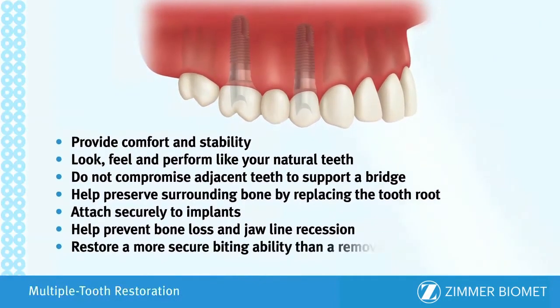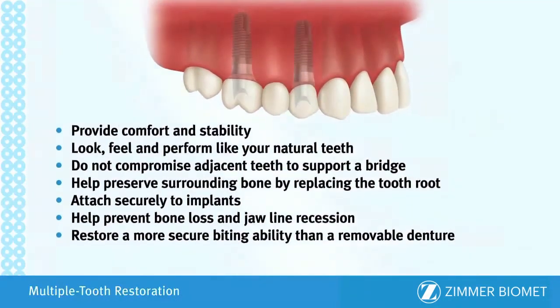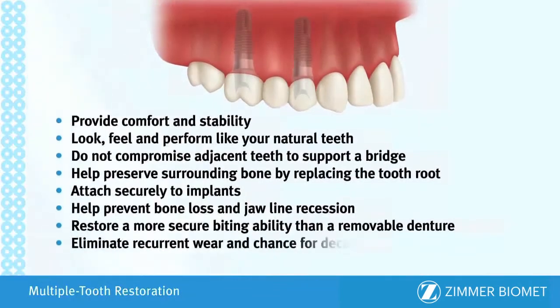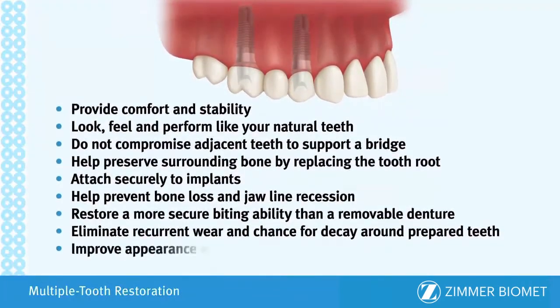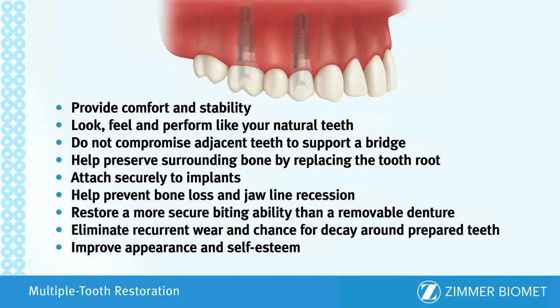Restore a more secure biting ability than a removable denture. Eliminate recurrent wear and chance for decay around prepared teeth. Improve appearance and self-esteem. Require similar oral care as a natural tooth.